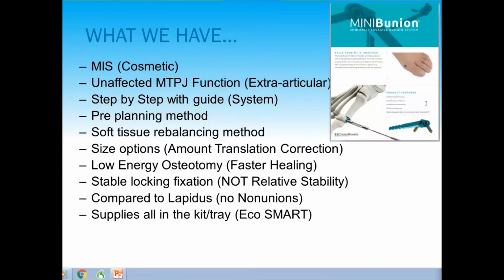So the question came in about translation. The level of the osteotomy, since I showed that one x-ray where I went more proximal: would you have to translate less if you went more proximal? And yes, that is true. As you go more proximal towards the CORA or the apex, you don't need to laterally translate as far if your osteotomy level is closer to the Lisfranc joint rather than further down by the head of the first metatarsal.